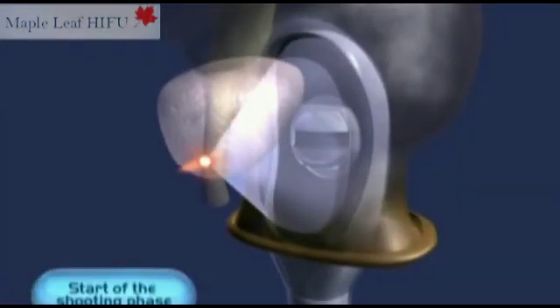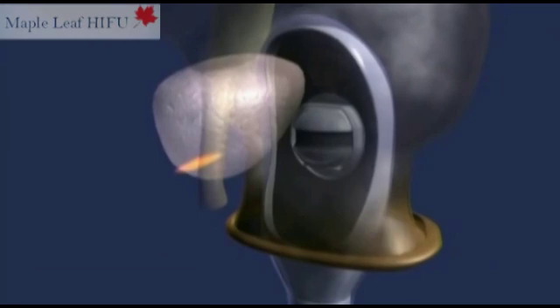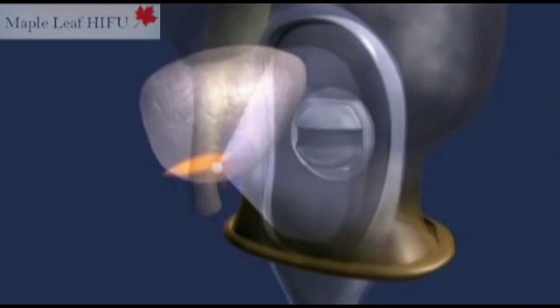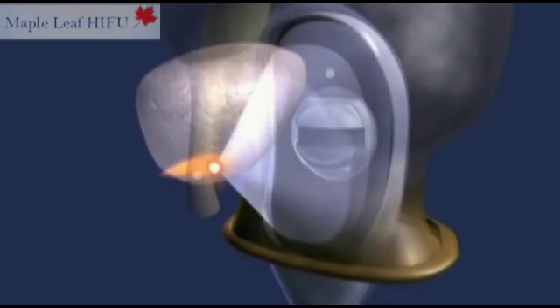Once the treatment has been planned, the shooting phase can begin. The robotic probe will then carry out the surgeon's instructions automatically and extremely precisely. Orders are accurate to a few millimeters.